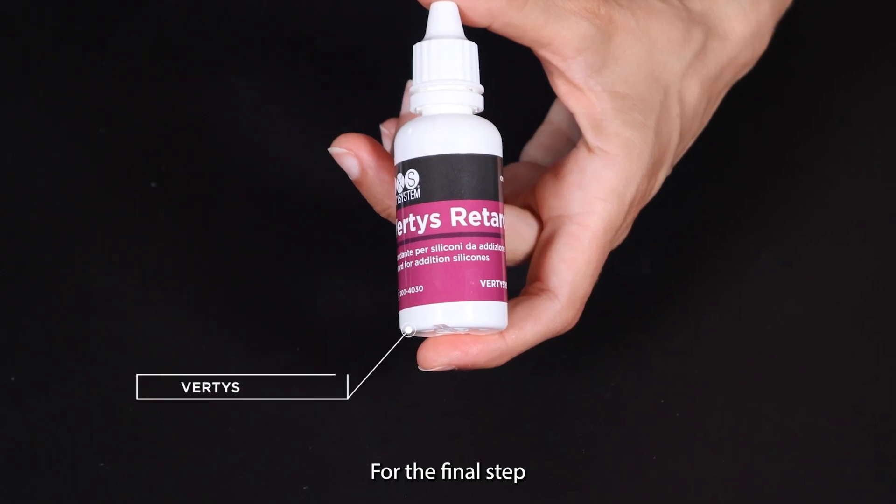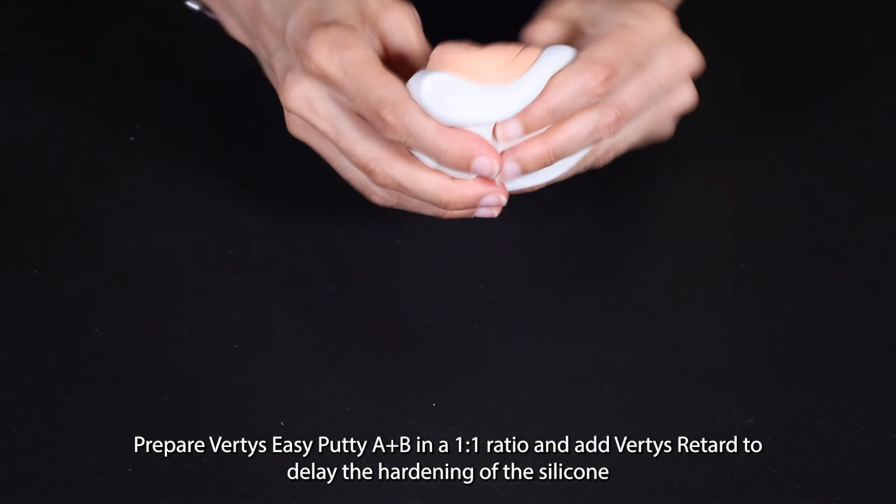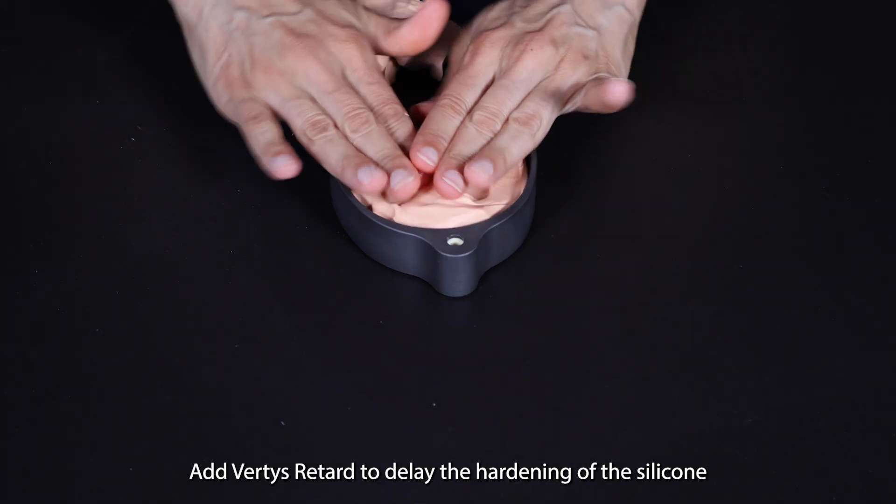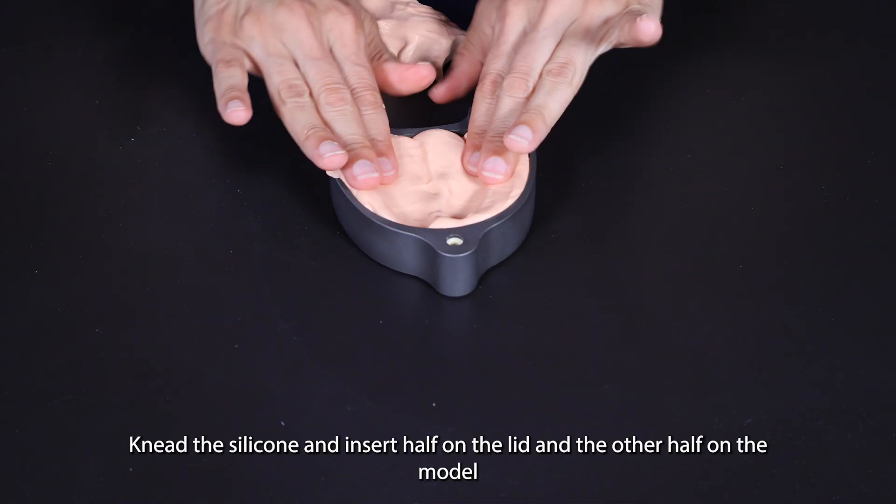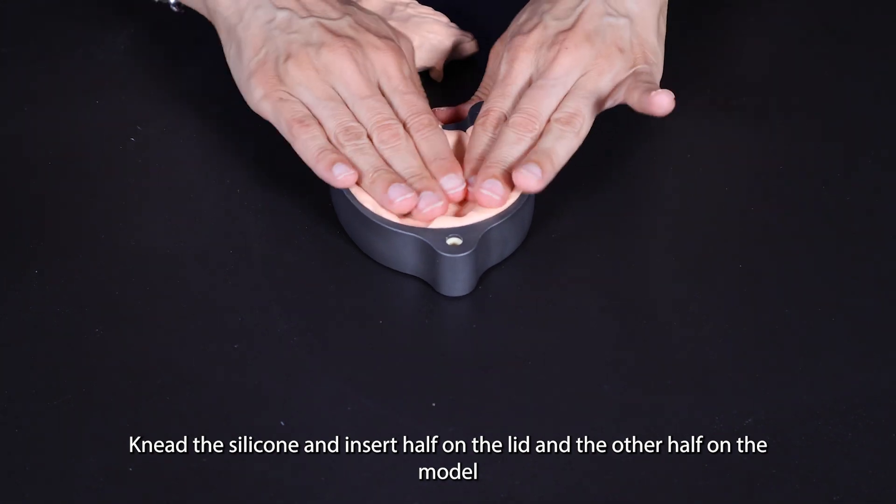For the final step, prepare Vertis Easy Putty A plus B in a 1:1 ratio and add Vertis Retard to delay the hardening of the silicone. Knead the silicone and insert half on the lid and the other half on the model.